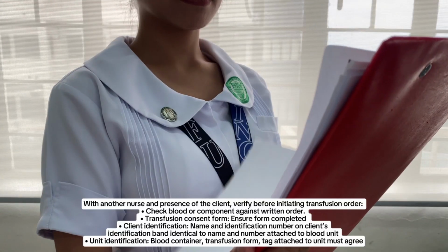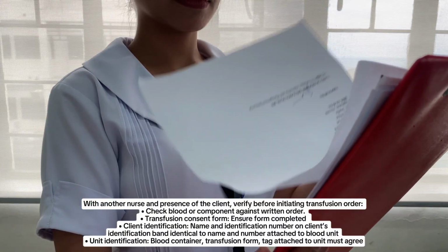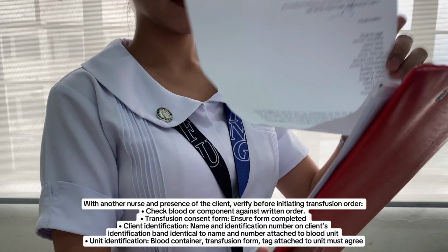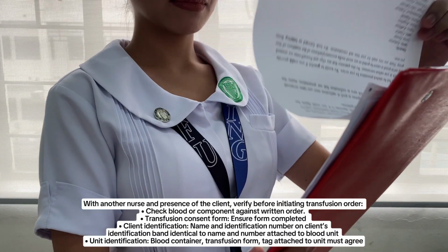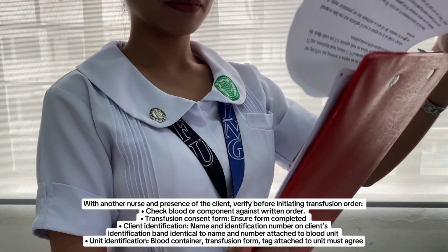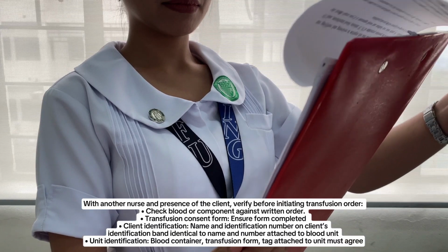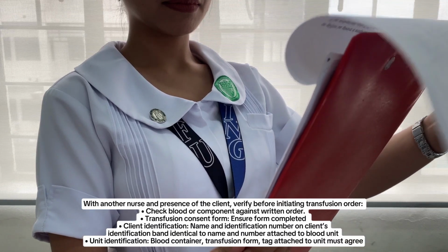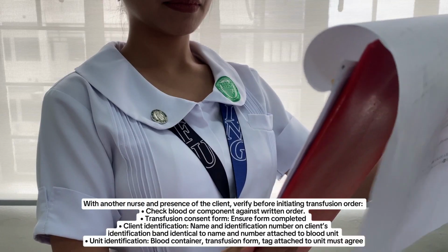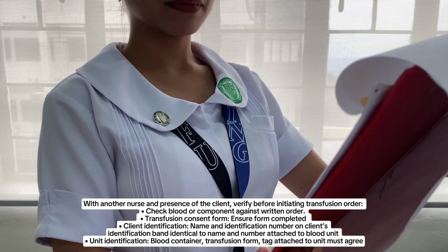With the presence of another nurse and the client, verify before initiating the transfusion order. Check blood or component against the written order. Ensure that the transfusion consent form has been completed. Identify the client using their name and identification number from their identification band, ensuring that the name and number attached are identical to the blood unit.